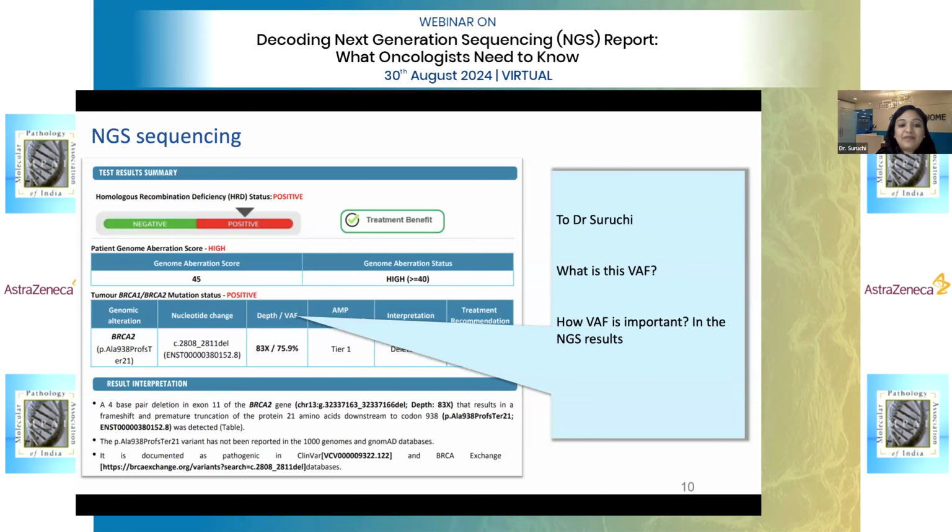Sure, sir, definitely. My pleasure to answer this question. VAF stands for variant allele frequency, and it is a very important parameter in next generation sequencing. NGS differs from Sanger sequencing in that we sequence a particular position multiple times. Those multiple sequences that we get, we call them reads.